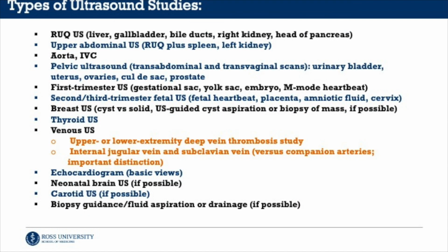And on this slide, we have a list of the most common ultrasound investigative studies.